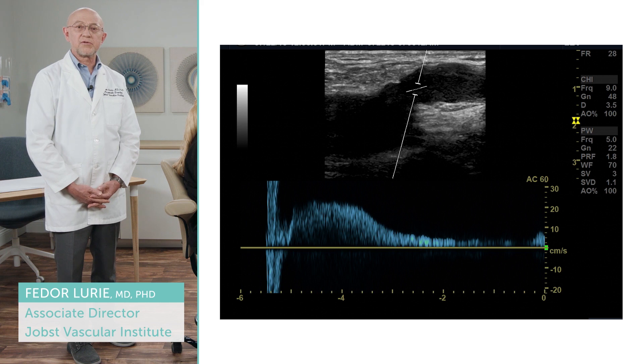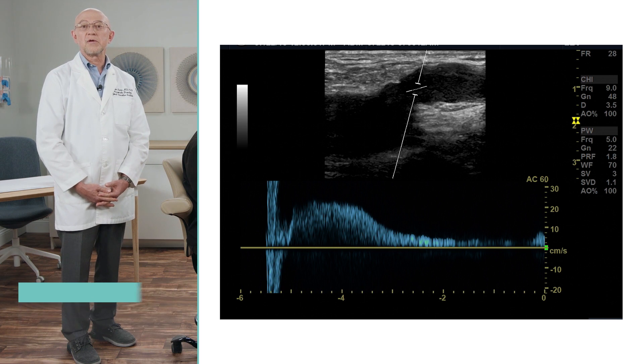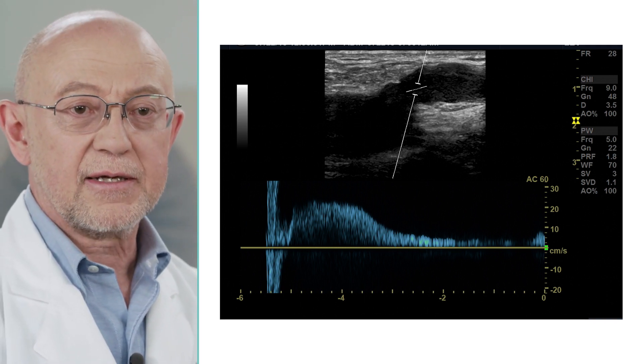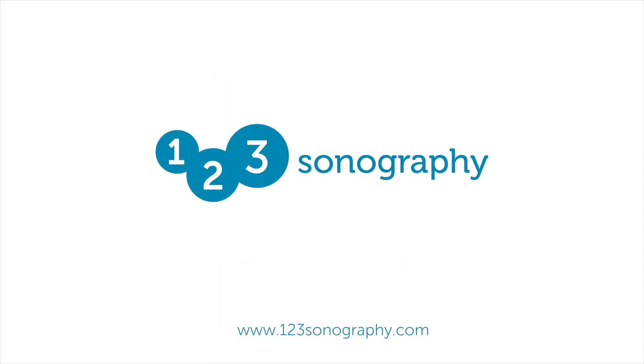We have augmentation of the flow and the reversal of the flow at the cuff deflation. The reverse flow duration is definitely longer than 0.5 seconds, and that is the criteria for reflux. The other side is notched up — actually good, if that was a barrier.